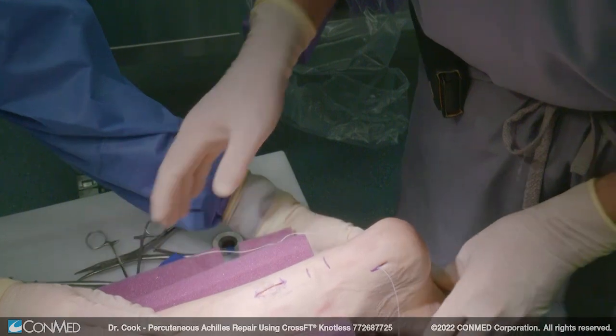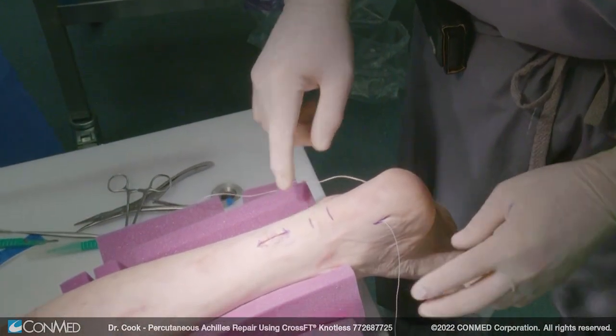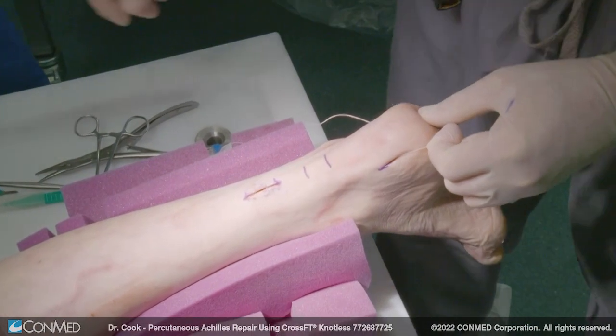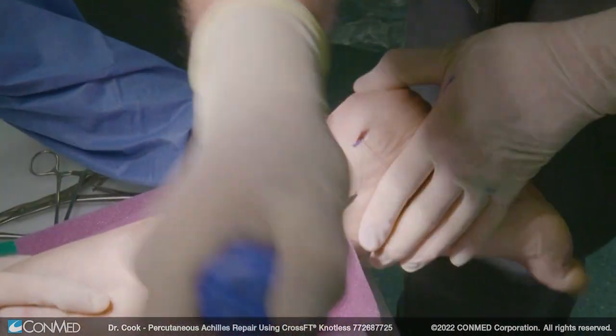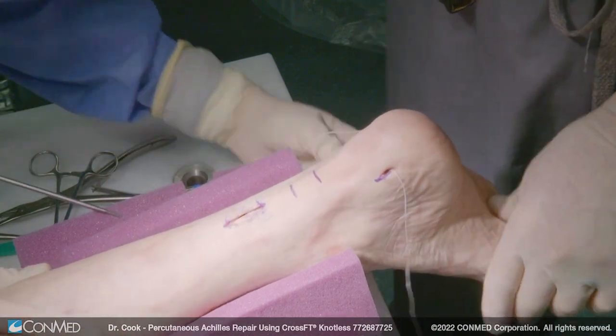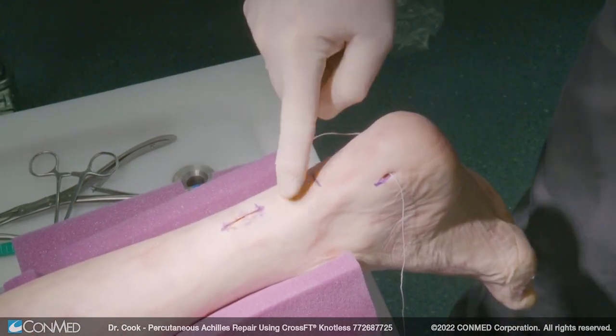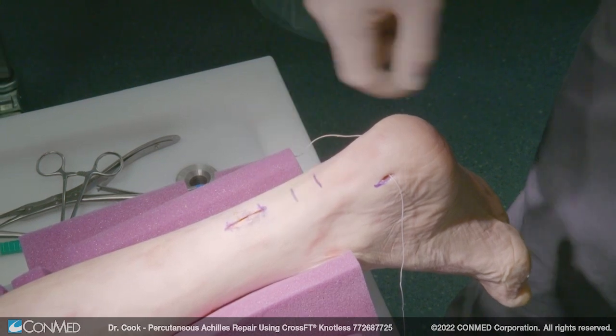You have the ability to tighten it up a little bit more on the other side if you wanted to. So we'll do the same thing, and now you have this excellent repair to your Achilles. You can see the posture of the foot has been restored back to its natural plantar flex posture.